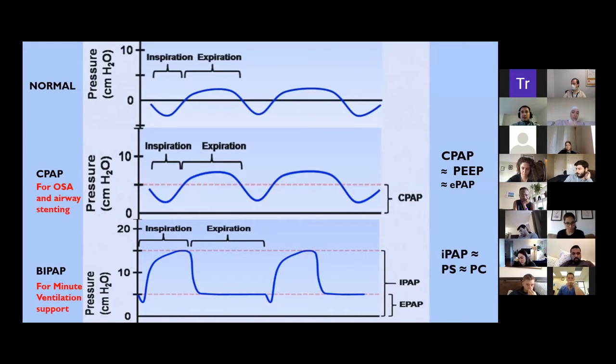Now, general indications, and this is going a little bit farther into advanced, is that CPAP, we only use it in 2 scenarios with real world indications. One is OSA and the other one is when you need airway stenting. What am I talking about, airway stenting? For example, if you have someone with tracheobronchomalacia, or someone with EDAC, excessive dynamic airway collapse, meaning their airways are too floppy posteriorly and they start to collapse, then those patients need to sleep with CPAP, otherwise their airways collapse when they're sleeping and they start retaining.